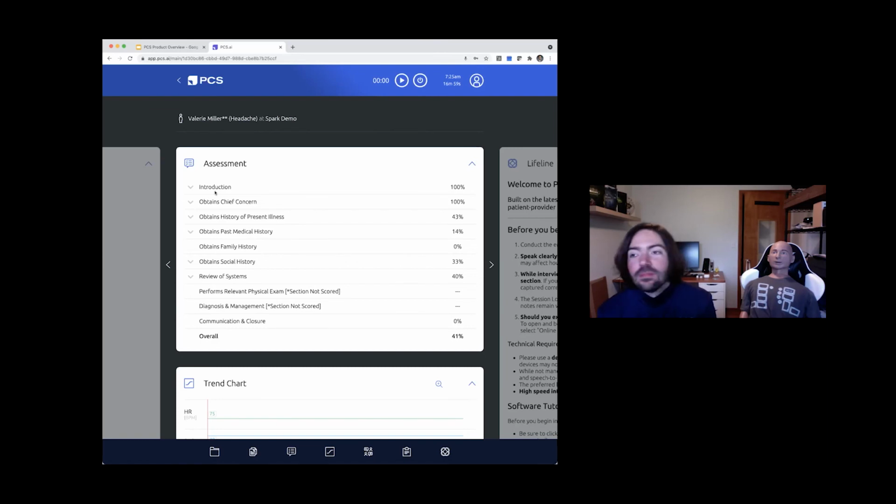Yeah, there is a question which says, what's the difference between AXEL and ALEX? So the difference is that ALEX has that speech functionality. The same speech functionality that we just saw here with Spark, ALEX is able to have those same kinds of conversations. But AXEL is a non-speaking simulator, so more of a traditional patient simulator, but you do have that walkie-talkie or push-to-talk functionality, so you can still utilize the speaker in AXEL to have a facilitator speak as the patient, if you will.